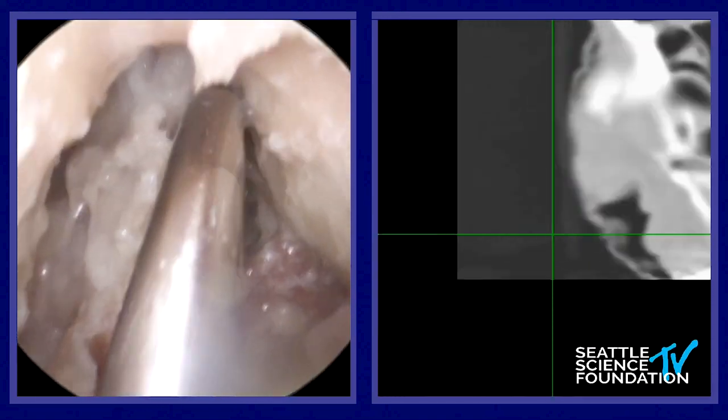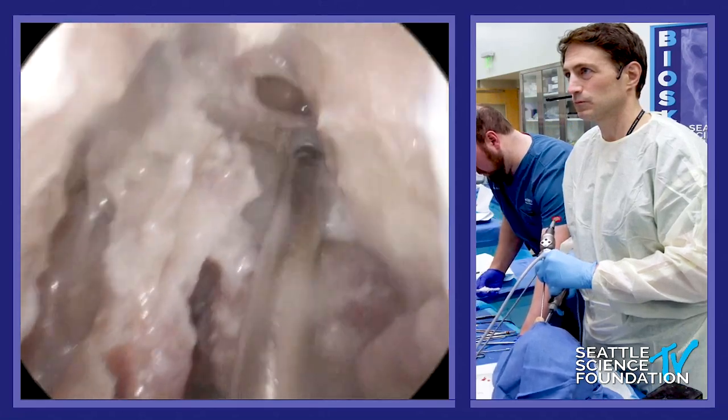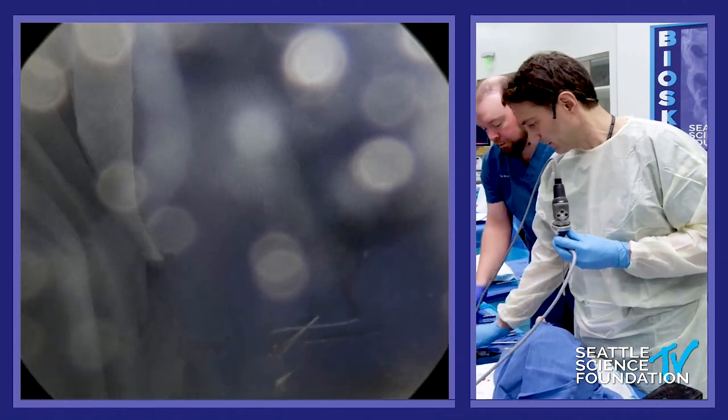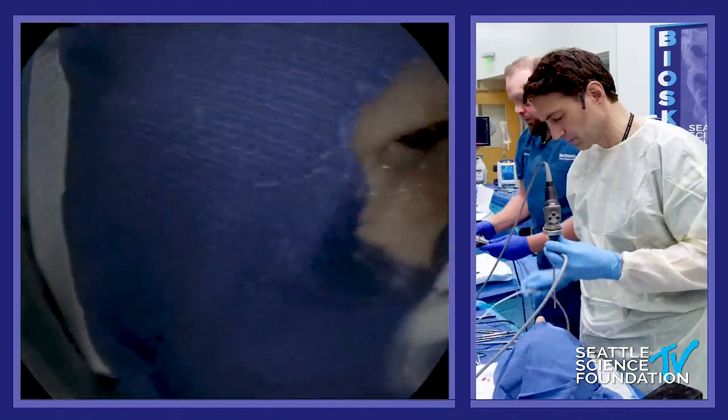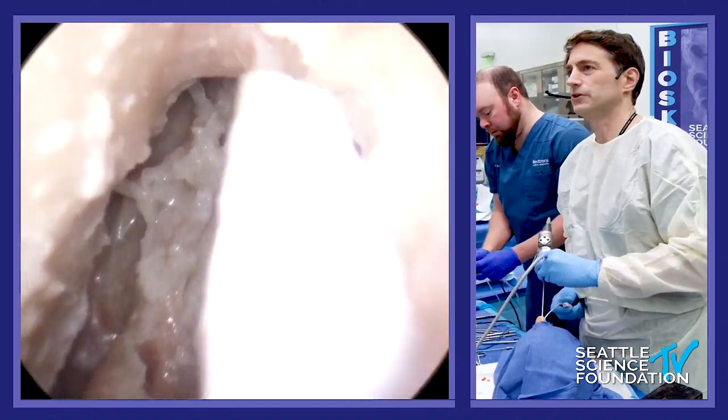Can I see a straight debrider please? I'm just going to debride that.